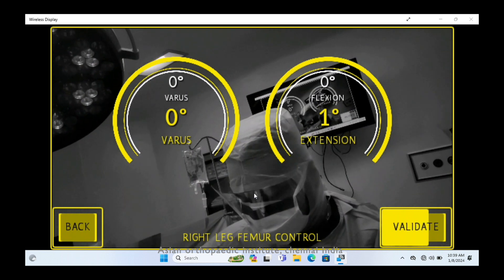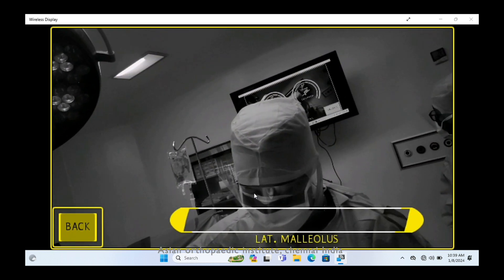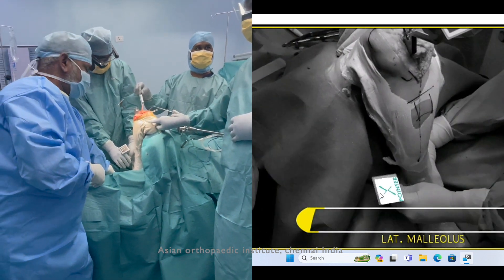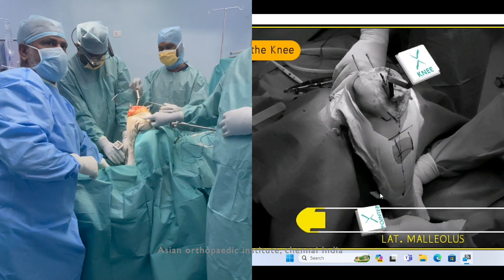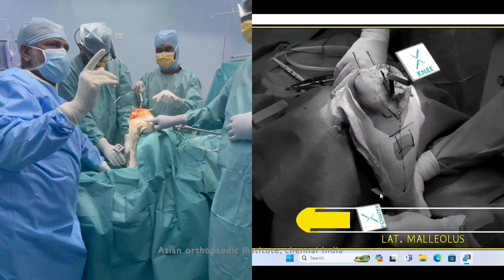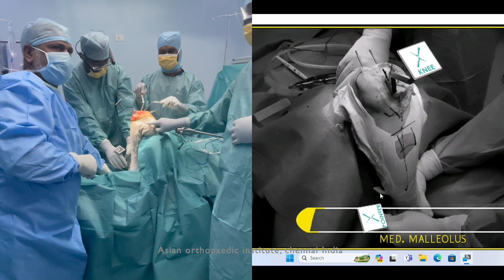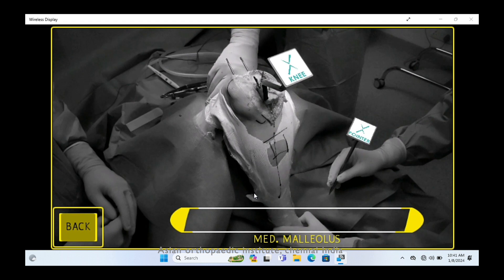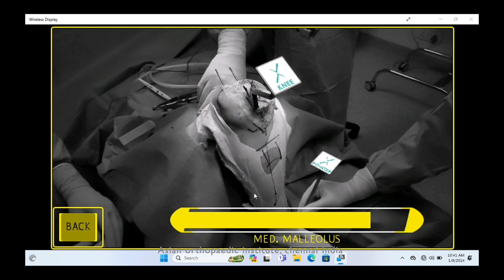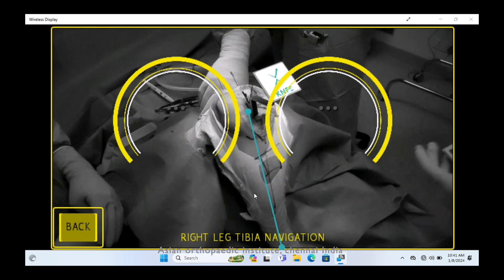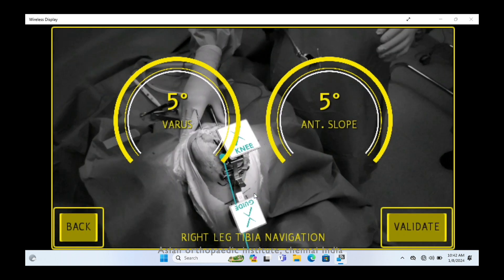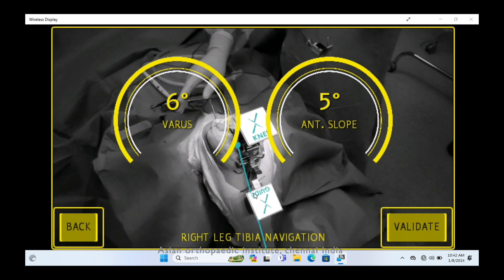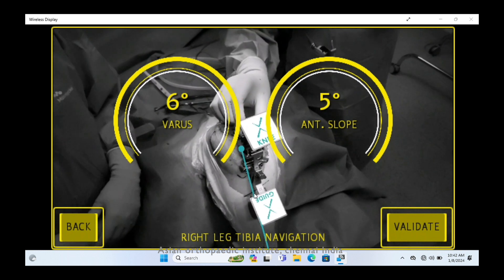For the tibial cut, we place the tibial reflector at the tibial entry point at the spine, then acquire the landmarks of the lateral malleolus and medial malleolus. By focusing your augmented reality specs, it takes the landmarks and shows the tibial axis in real time, giving you varus/valgus and slope so you can adjust the cutting guide.